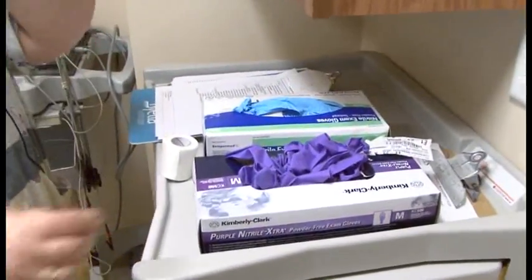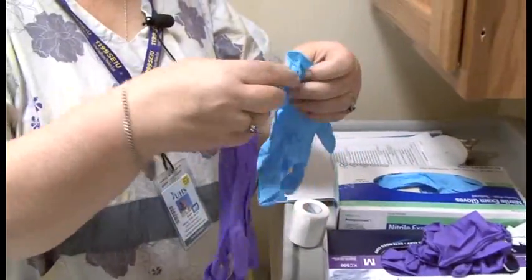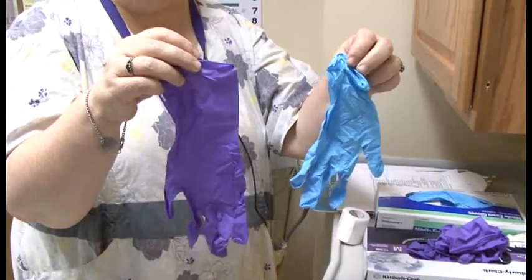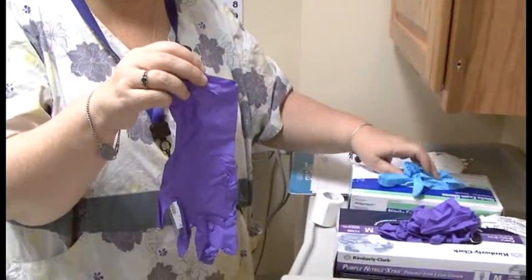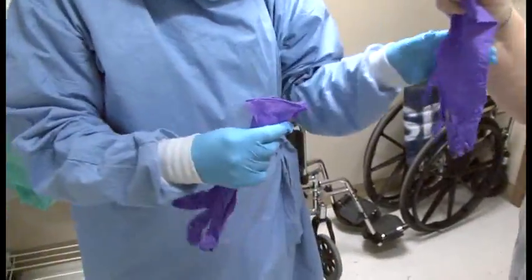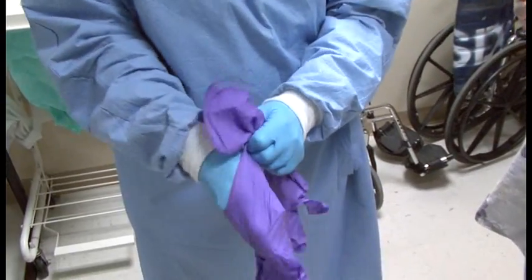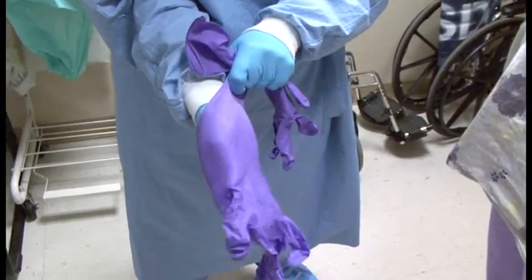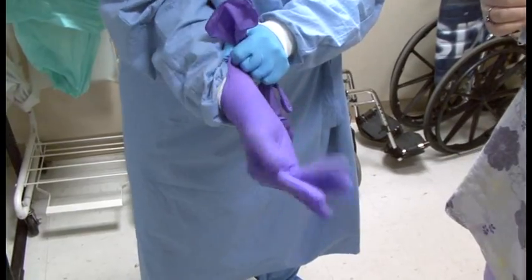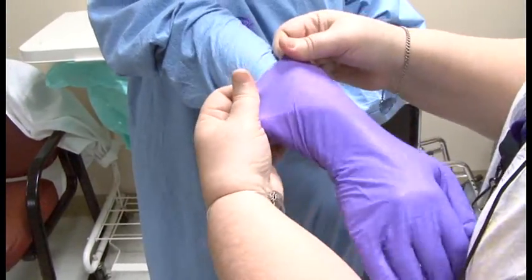The next thing Lynn will be putting on is the purple nitrile gloves with extended cuffs. You can see the purple ones are longer, going up the forearm much more, making it less likely for them to come off. Lynn starts putting them on, and sometimes a person needs a little assistance, especially getting the cuffs. The gown cuff has to go inside these gloves, which isn't the easiest thing to do, so the observer steps in to tuck the gown in really well.